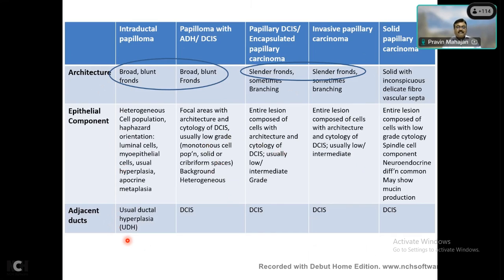And interestingly, if you see the ducts adjacent to the papillary lesion, in intraductal papilloma the adjacent ducts may show usual ductal hyperplasia, but in other lesions, sometimes you can have DCIS.